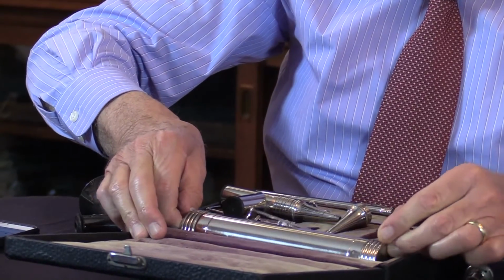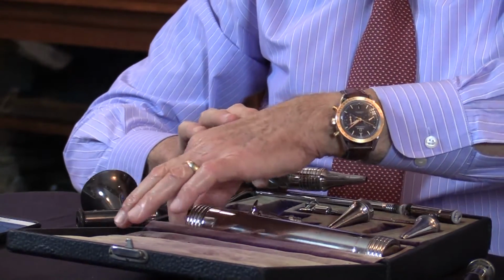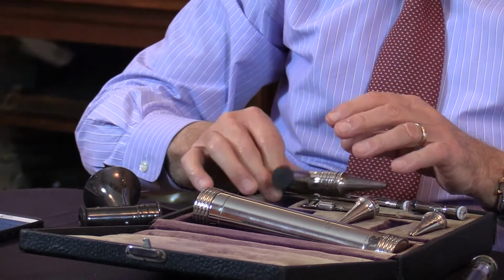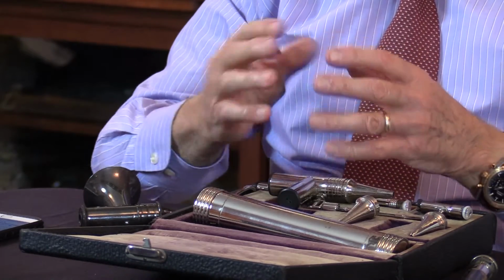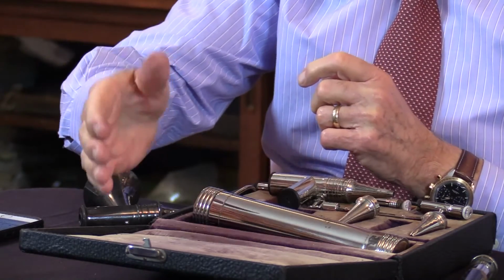Then when they developed batteries, they used the same kind with a battery or electricity. So it has this ability to use any kind of electric light source. So I believe that this is a breakthrough.